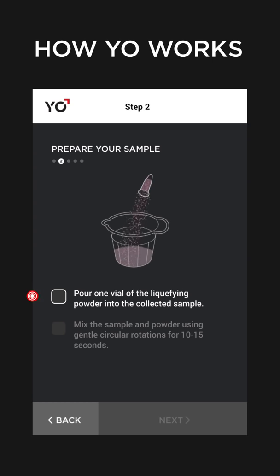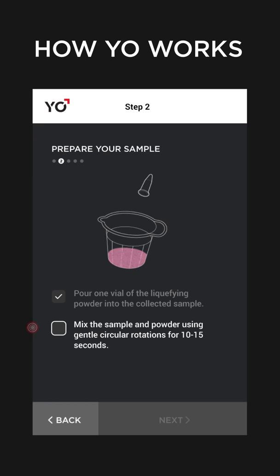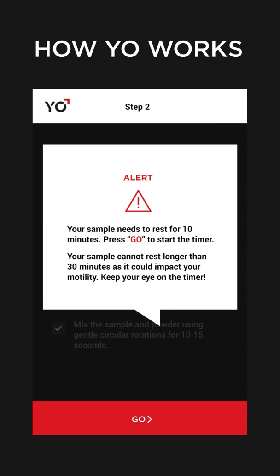Prepare your sample by pouring the liquefying powder into your sample and mix it up as instructed. Your sperm needs to rest for 10 minutes. Tap Go to start the timer.